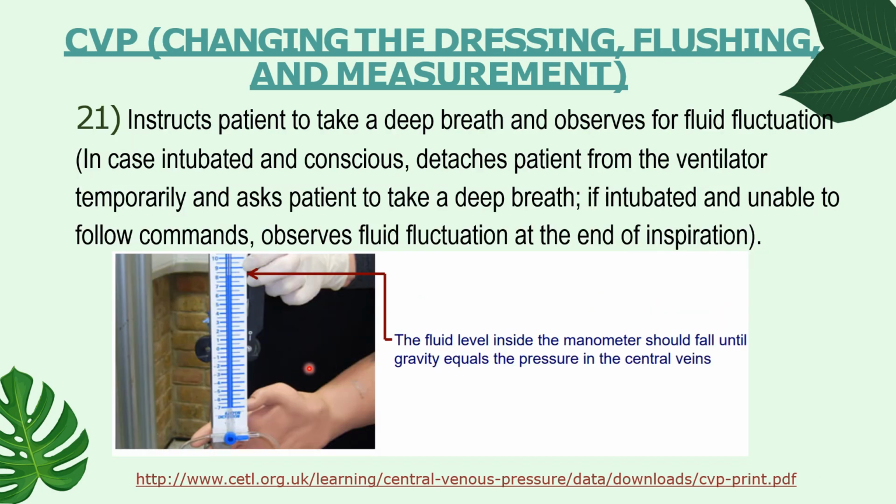Now you can instruct the patient to take a deep breath and observe for fluid fluctuation. In case the patient is intubated and conscious, you can detach the patient from the ventilator temporarily and ask the patient to take a deep breath. If the patient is intubated and unable to follow commands, you can just observe the fluid fluctuation at the end of inspiration.